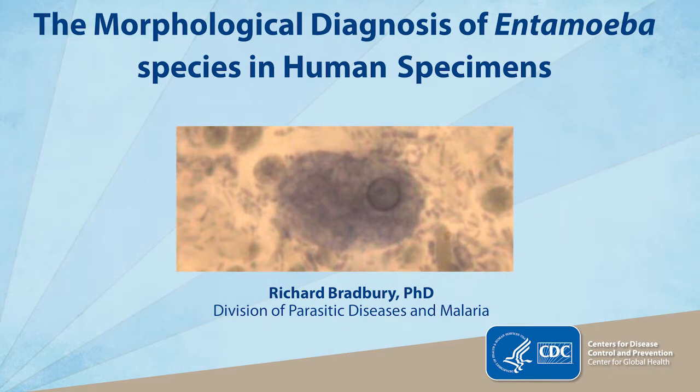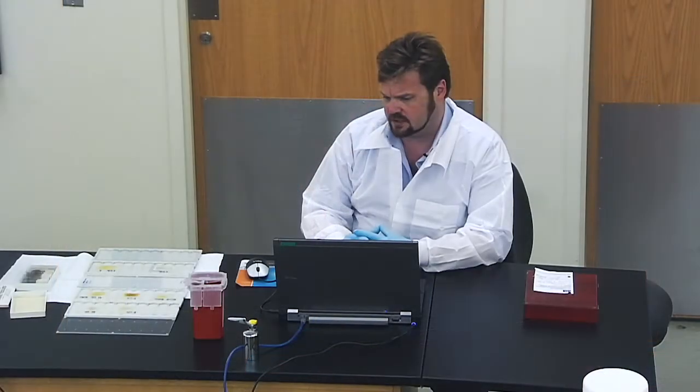What I wanted to do when I got asked to do this webinar, I thought about different options which would be helpful to people in clinical laboratories. And what I struggled with a lot when I first started doing parasitology was the diagnosis of Entamoeba species. So we would get a lot of specimens through in labs, which I worked in hospitals, from particularly refugees, full of Entamoeba. And when you haven't seen a lot, it can be quite difficult to differentiate the species.